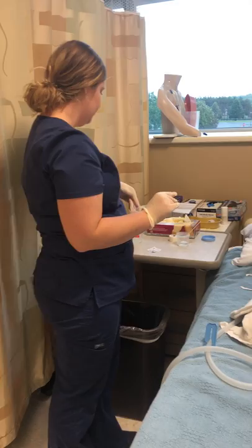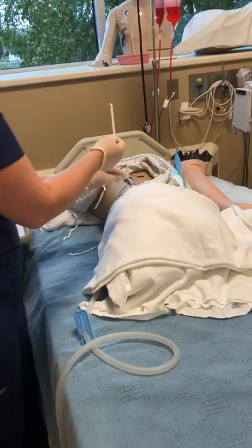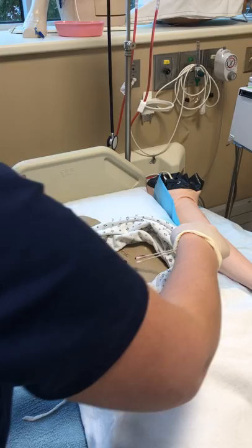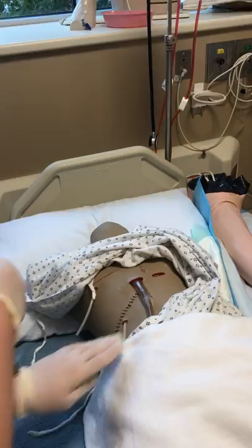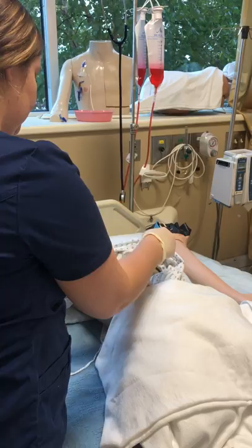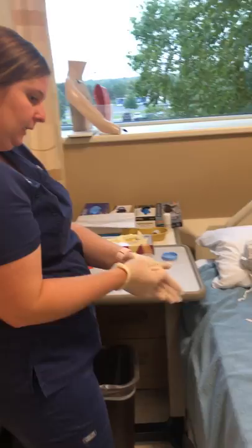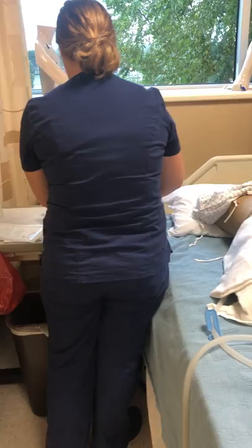I'm going to take cotton swabs and cleanse the area. I'm going to grab my other ones. Cleansing the area, move it away. And I'm going to take my skin prep. I would open it and place it around where the wound would be. That would go into the garbage. And I'm going to remove these gloves and set all this aside.